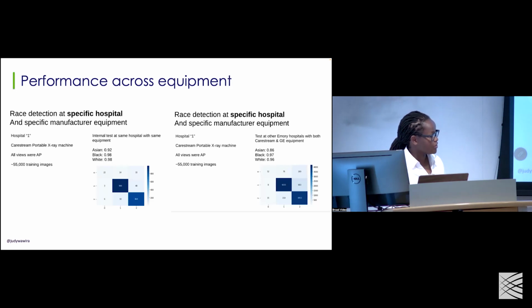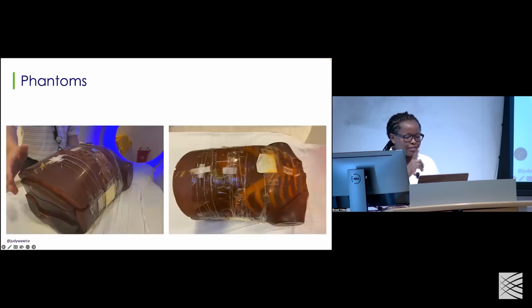A lot of people are trying to publish this. Actually, we're going to see some of these types of papers come up, and they're trying to manually change the physics. It's very difficult to do from JPEG. Please don't do that. That's not helpful. And so we were able to just look at test X-rays from our hospital. It's not the equipment. That was the big thing. This is something that we've never been able to expand on, and was also a good learning point for me. Every device that we use has to be calibrated.